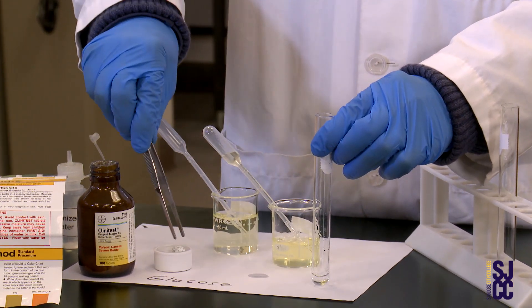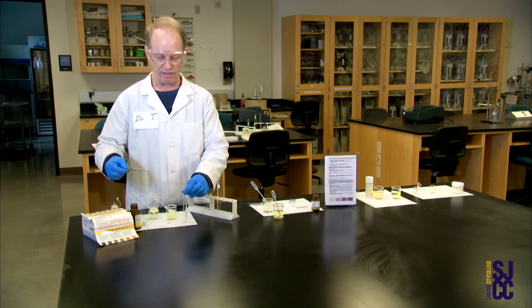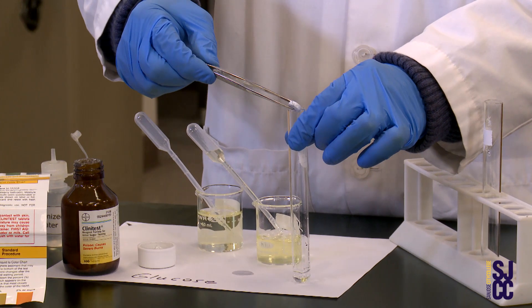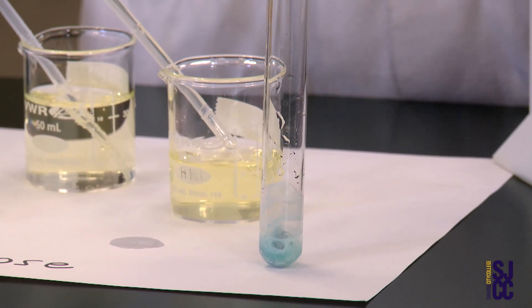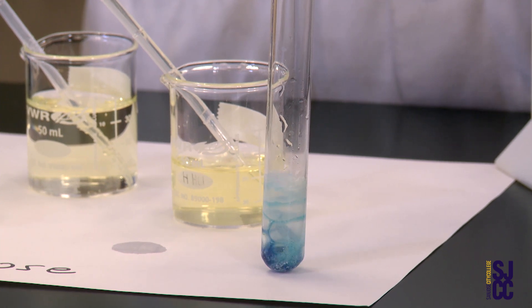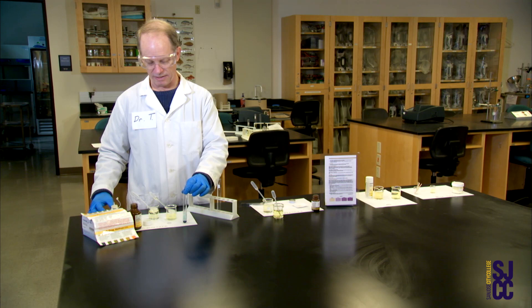Now for the fun part: putting in the Clinatest tablet. I'm using forceps because I know it's loaded with sodium hydroxide. That makes it fizz, makes it pretty, makes it hot, makes it react. These are old tablets, but here we go. It's fizzing — it looks like Alka-Seltzer having fun. It's boiling now, and once it's done boiling the reaction is over. That's as good as it's going to get.